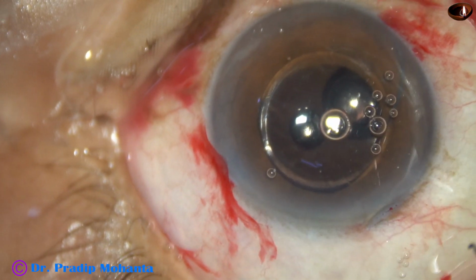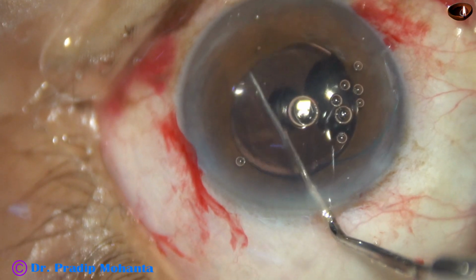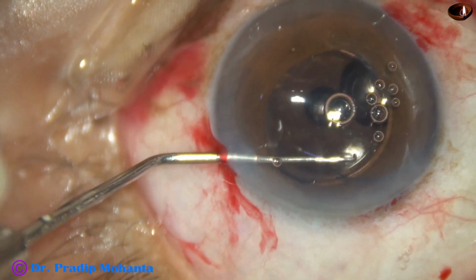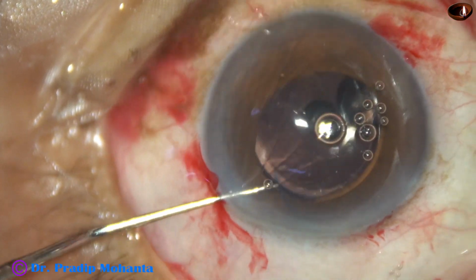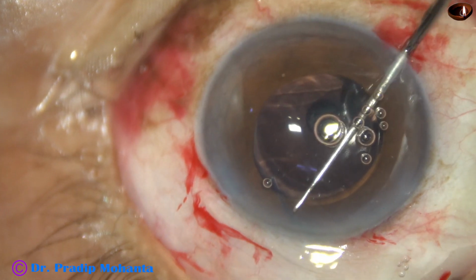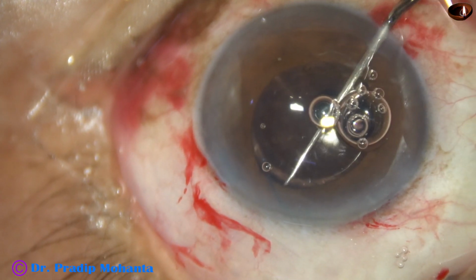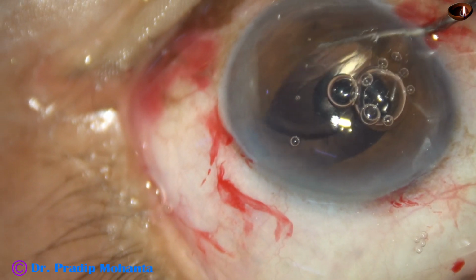And now with the help of hooks, the leading haptic is brought at 12 o'clock just in front of the main incision. Then it is pulled a little beyond the main incision. Now through the right side port, the lens is dialed in this way so that this haptic goes in the sulcus.